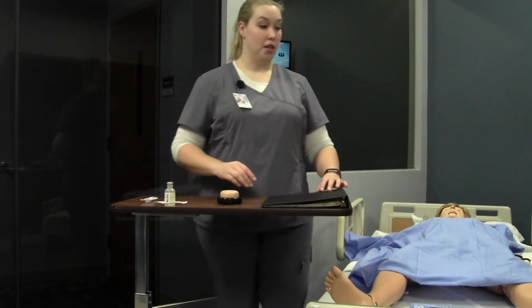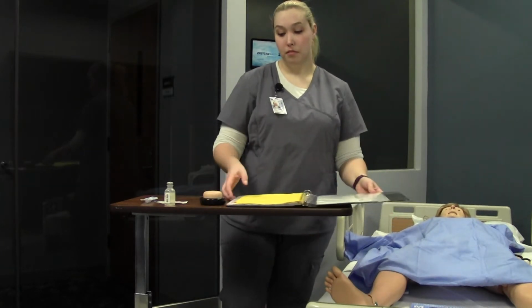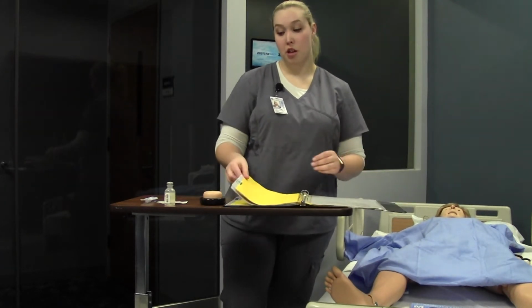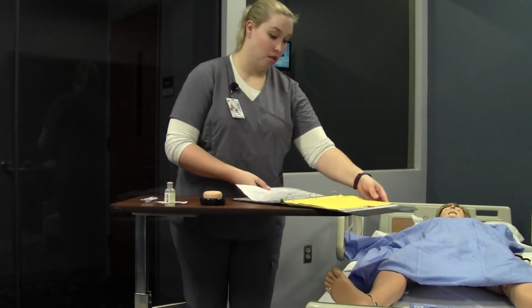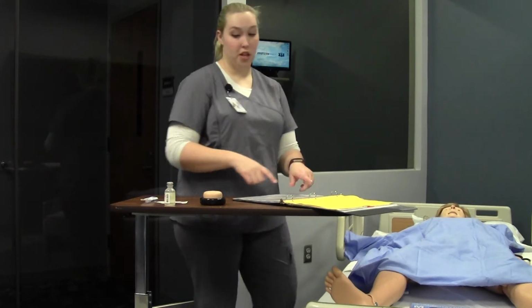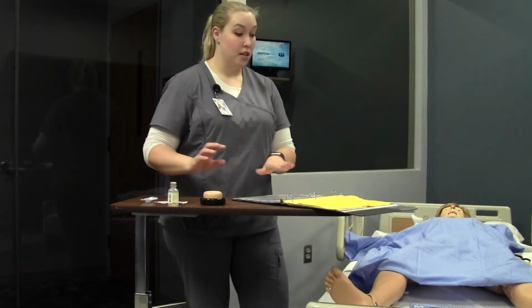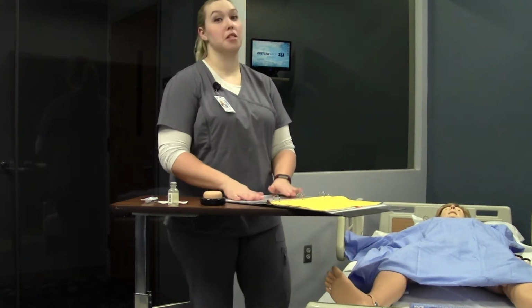I need to make sure that I have the correct patient, so I'm going to go ahead and check my MAR to make sure that I have the right patient, the right drug, right dose, right medication, route, time, everything. So I've checked to make sure I have tuberculin solution that is due. I'm going to then take my patient's chart with me to my patient.